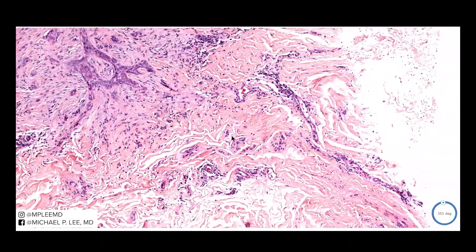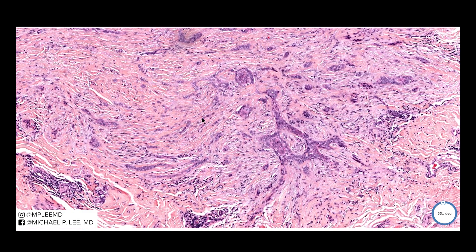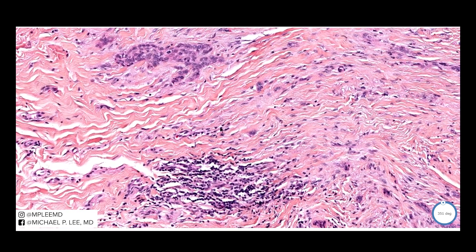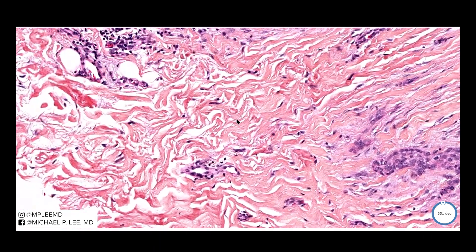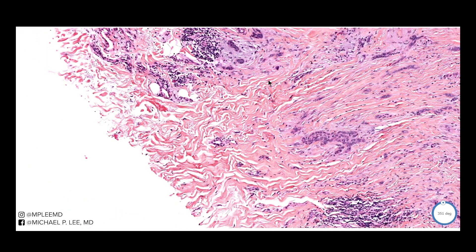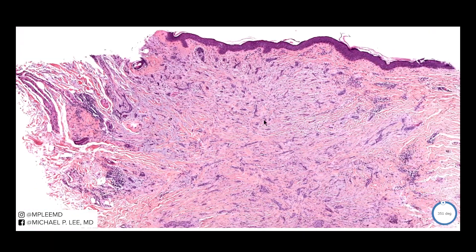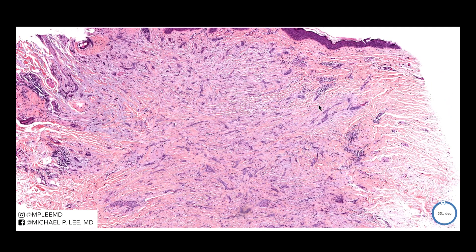So again, there are no horn pseudocysts. You can see very thin, small, single-cell to two-cell-layer thick cords, almost single-filing or a single-line-like arrangement of structures. These things can commonly involve nerve, with very little retraction artifact that you would typically see in a basal cell carcinoma. These are seen in older people, typically anywhere on the head and neck. And if you remember, CD34 is positive in trichoepithelioma stroma but negative in basal cell carcinomas.